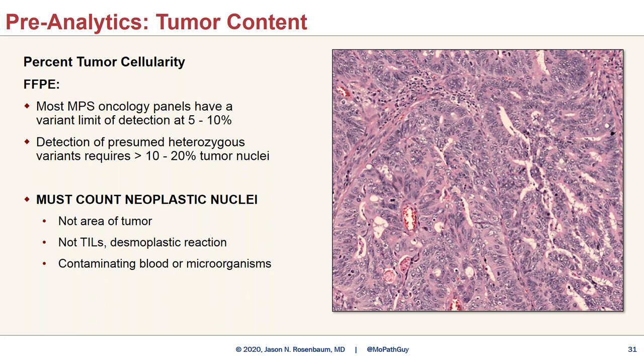But the problem is, from the perspective of the DNA-based assay, what you're really concerned about is the amount of DNA that is tumor. And for those of you that aren't used to looking at images like this, these dark, dense, round nuclei are lymphocytes. These big, puffy nuclei that are paler, and some of them have little white clearings, and you can often see dark nucleoli in them, these are the cancer cells. And still, most of the specimen is cancer, that is true. But it's not 100%, not by any stretch. You have lymphocytes here, you have fibroblasts, probably a blood vessel here.